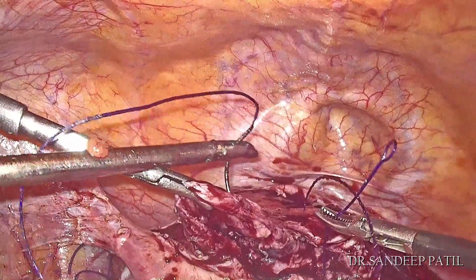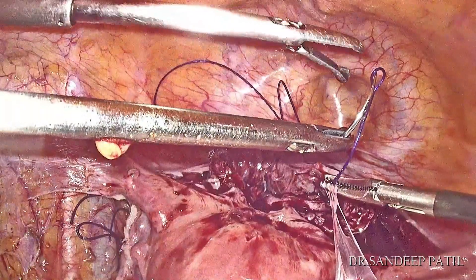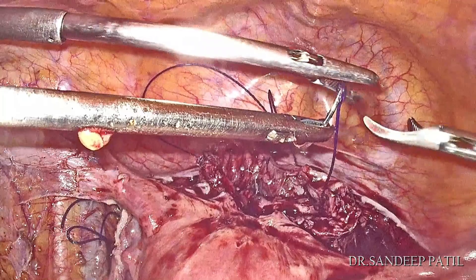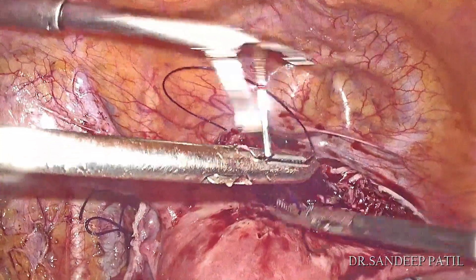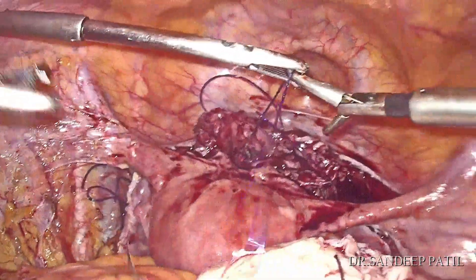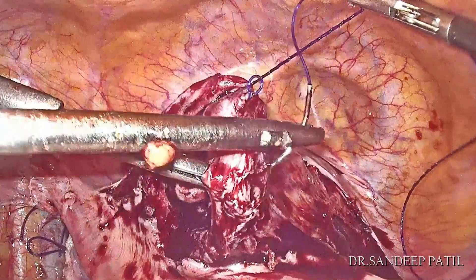In this case, we have used V-lock sutures. One can use vicryl sutures also and it is a personal choice. V-lock sutures are better for suturing of the myoma bed as they are self-anchoring.